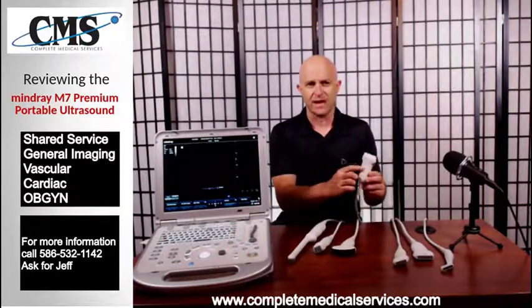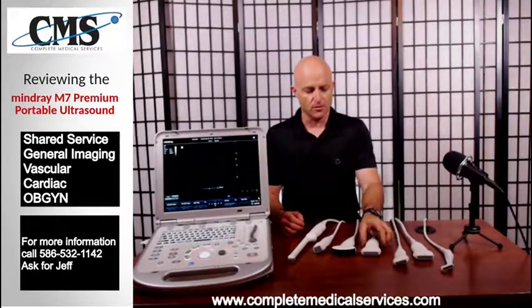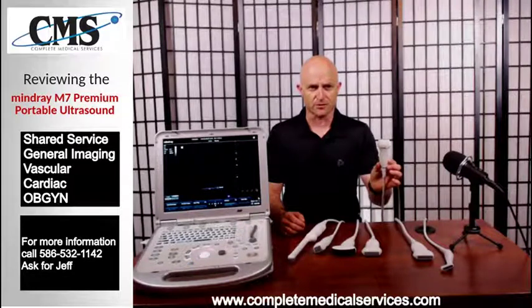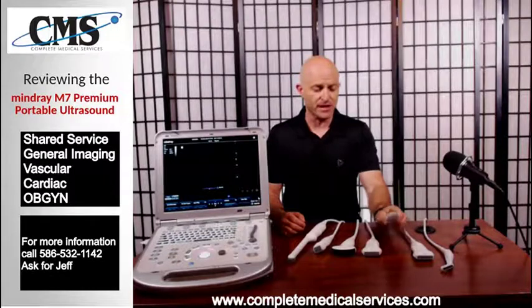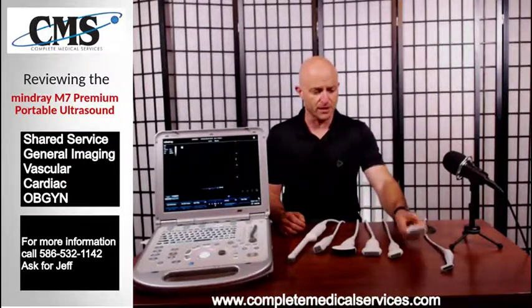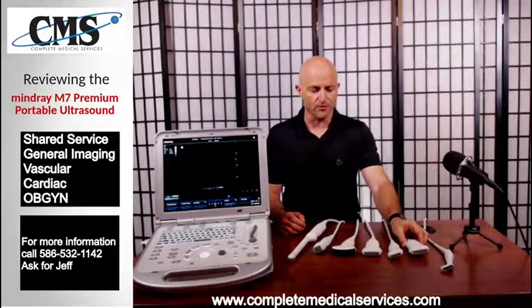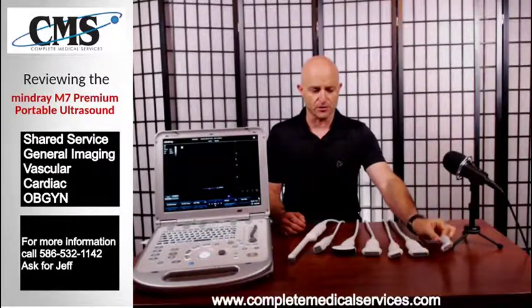This is the L7-3S, which is a 3 to 7 megahertz linear transducer with a typical standard 38 millimeter footprint. Then we have a smaller footprint linear transducer, the L14-6S, which is a 6 to 14 megahertz transducer. There's also a 38 millimeter version called the L14-6NS, which we don't have here today. It looks very similar to the L12-4S, which is a 4 to 12 megahertz linear transducer, and then finally the hockey stick linear transducer.